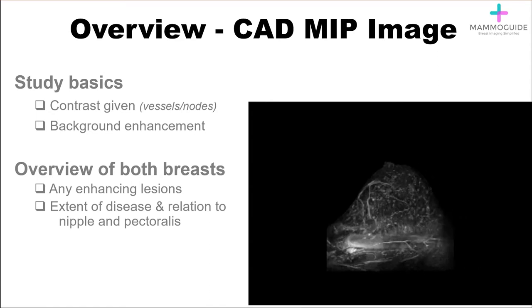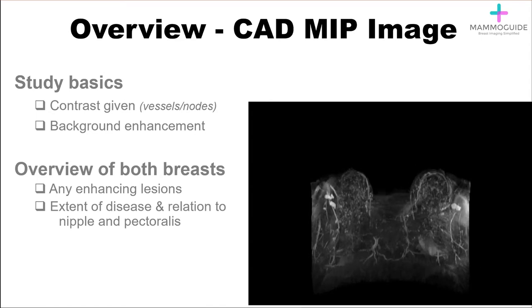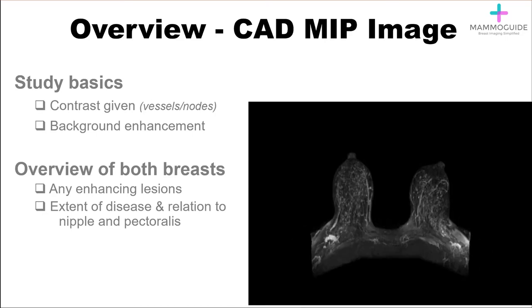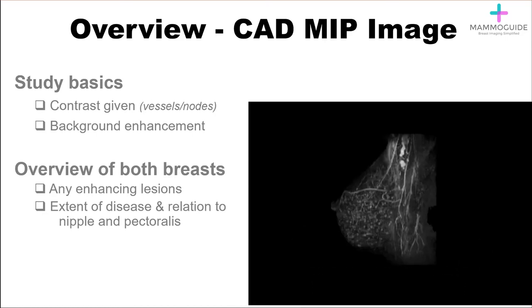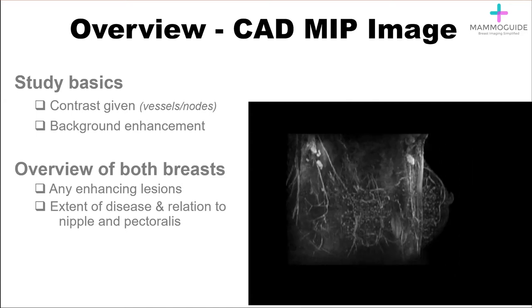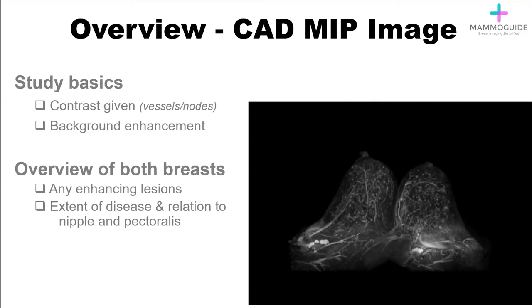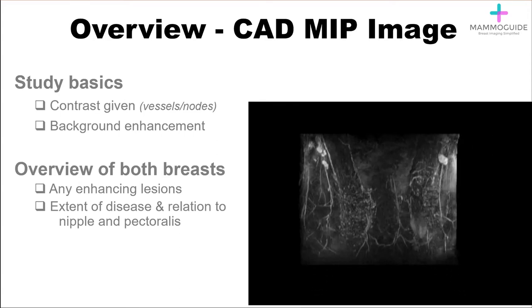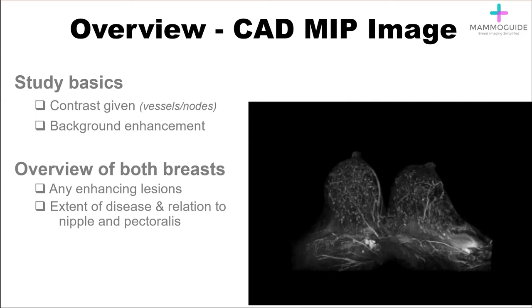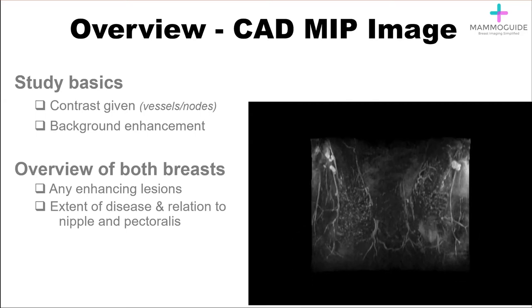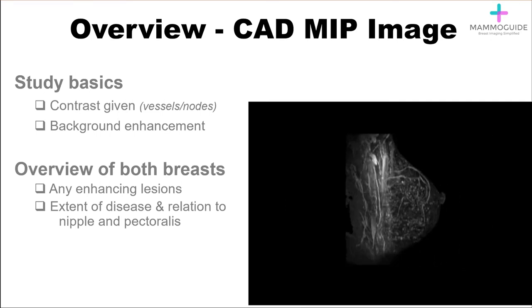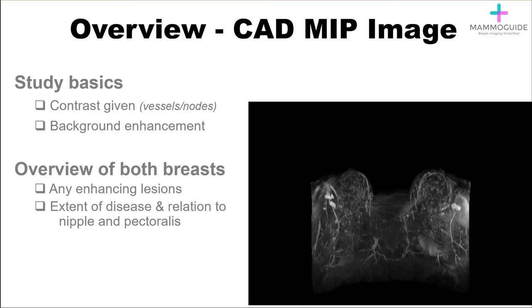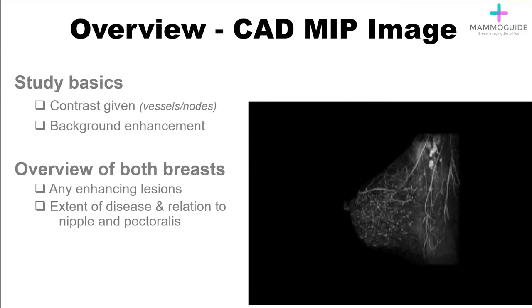Next, look at the maximum intensity projection image. This image, created by the CAD software, gives a great overview of both breasts. It also helps you to evaluate and ensure that contrast was administered and allows you to evaluate the background enhancement. With this sequence, which you can scroll through and look at at any angle, you're looking for any enhancing lesion, and if there are enhancing lesions or known malignancies, this sequence is very beneficial to evaluate for extensive disease or look at the relation of the malignancy to the nipple and pectoralis.